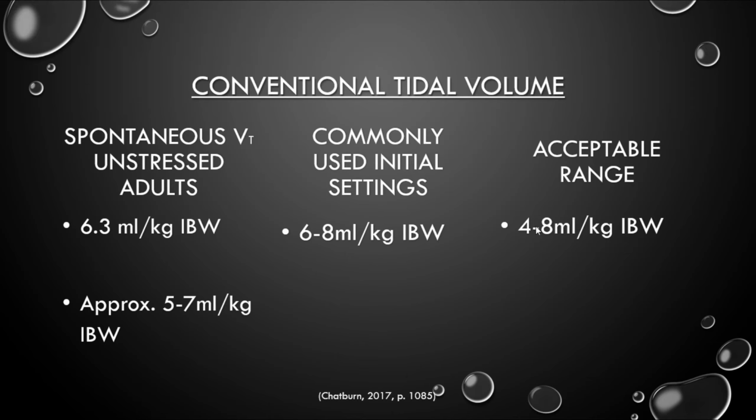Sometimes we can even go down to 4, and this is kind of following ARDSnet. You'd maybe use 4 mLs on patients with really high airway pressure, such as status asthmaticus patients. You want to keep those tidal volumes low.